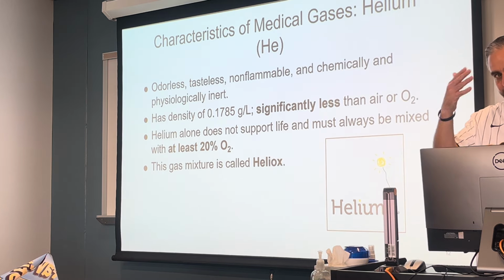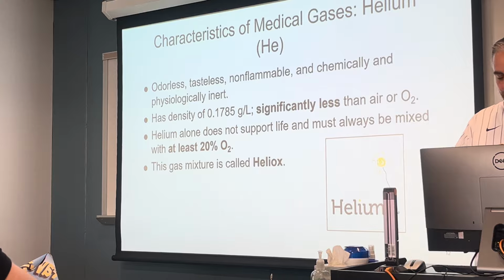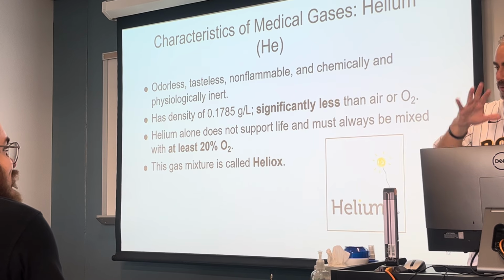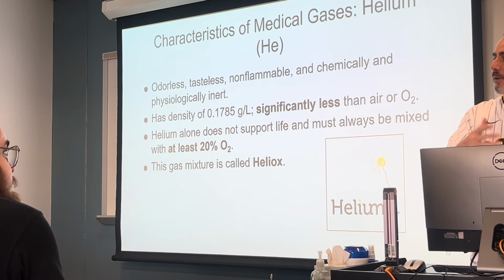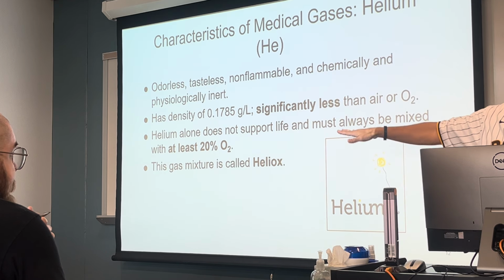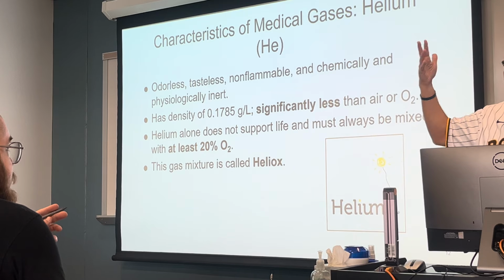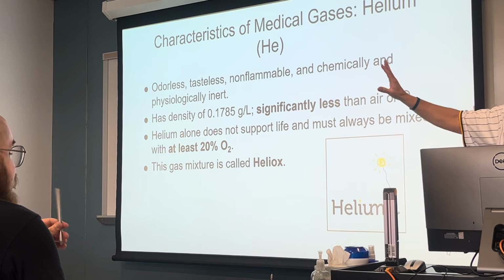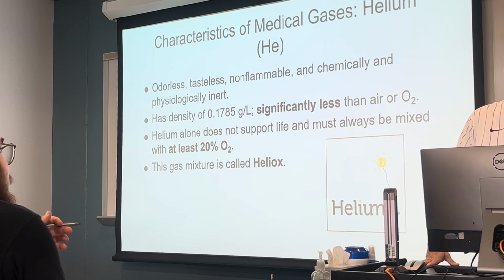I'm thinking about US Health, because they have one in the corner. One day I was there with my students, and somebody asked, is it okay? I said, yeah, go ahead, and they're blowing up balloons. It wasn't the respiratory department, it was one of the other floors, but they knew where to go when they needed balloons blown up. But what they were using was not heliox. That was just pure helium. Same thing, you can go to Walgreens or Walmart or Party City and get balloons blown up. They have it in helium, not heliox.